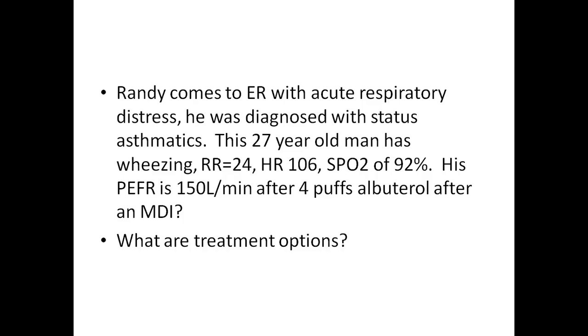So he has a high amount of airway obstruction, making it difficult to perform adequate MDI use, in addition to that high respiratory rate. So at this point, we have the option of an MDI, but probably a better recommendation would be to switch to a small volume nebulizer.